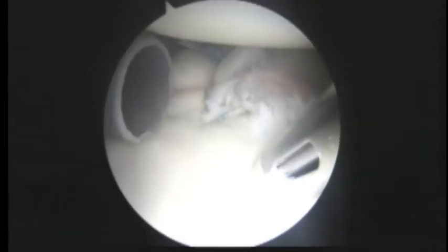Good, and now we can get to work in the front. Pause, please. What we're seeing here is that the detachment isn't that large, but there's a lot of damage to the cartilage. We're going to go ahead and start to place some suture anchors down, just like we showed you before, on the back side.